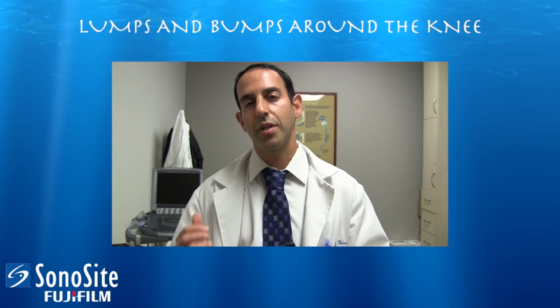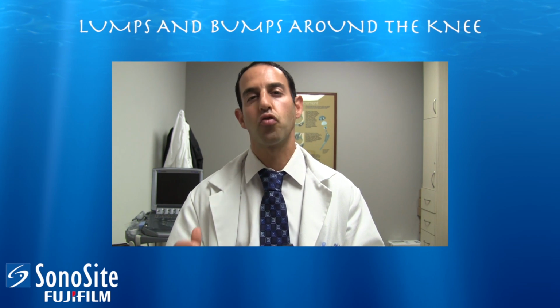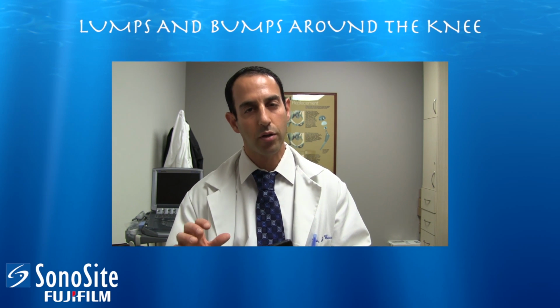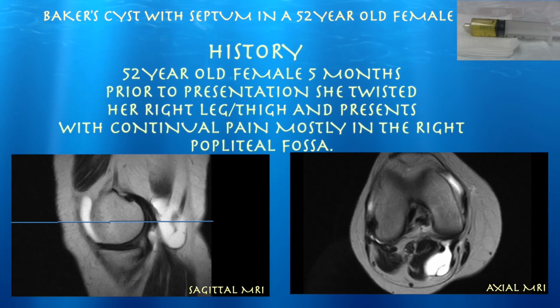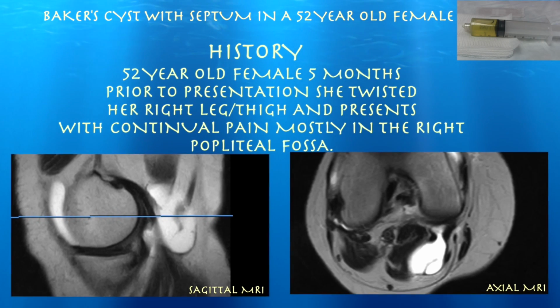In this case, you're going to see a Baker cyst that has a septum in it, in the distal third of it, and actually to drain this cyst, we didn't even need to breach that septum, we just needed to put the needle just proximal to it. Usually, however, in most cases, you need to breach the septum in order to get different compartments drained of the Baker cyst. This is a case of a 52-year-old female complaining of 5 months of pain in her right leg.